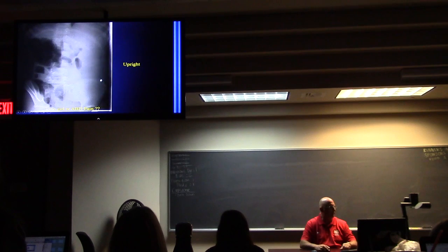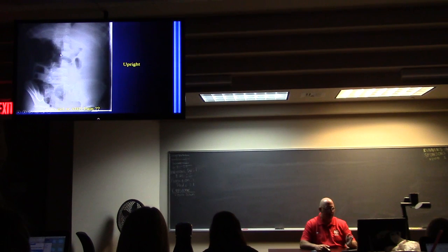So if they put something up like this, think to yourself, what the heck am I looking at? This is not right. You can ask the patient, did they lay you down? Did they make you stand up? You can ask the tech, what did you do? You should label this left lateral decubitus as opposed to upright.